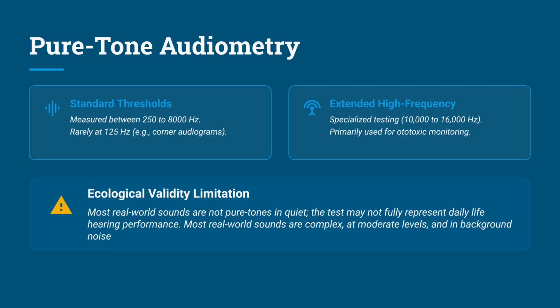There is an important thing to note here, the limitation of ecological validity. Most real-world sounds are not pure tones and quiet. The test does not fully represent daily life hearing performance. Most real-world sounds are complex at moderate levels and in background noise. So again, our intention is not to measure hearing at a realistic environmental setting. Our intention is to measure hearing in a standardized way to measure the loss of audibility.